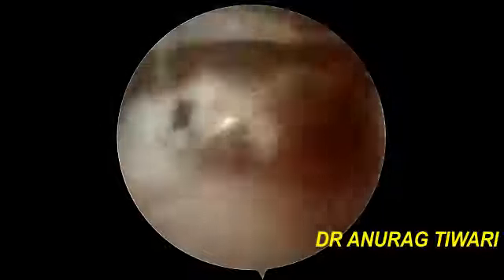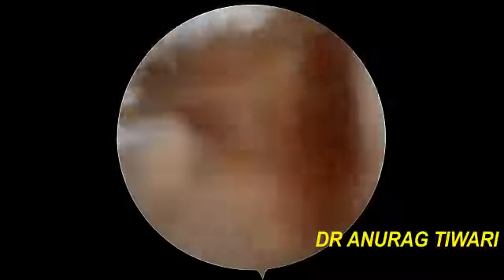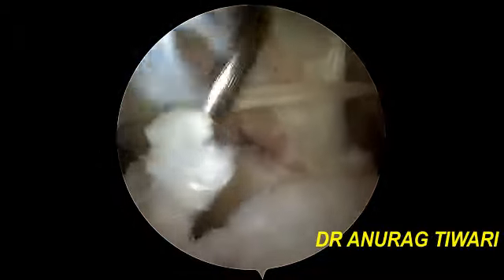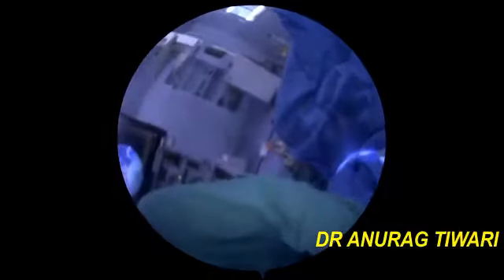Now is the time to shuttle the sutures from the femoral side, which are in the anteromedial portal. We'll take them back to the tibial side. Just reaming the edge of the tibial aperture. Sometimes the graft gets stuck in this tissue. You take the suture retriever or the depth gauge, as in this case I have taken the depth gauge, so you can retrieve the sutures through the femoral tunnel to the tibial tunnel. Now the sutures are passing through the femoral tunnel and the tibial tunnel.